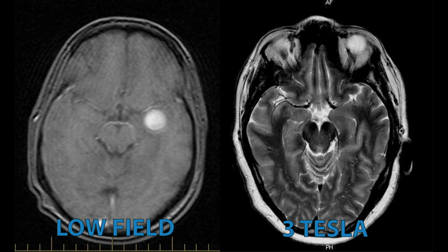There is now being used at a small number of facilities what's called a 3T MRI machine. And that is a much higher resolution MRI than the 1.5 T, and certainly much higher than the 0.2 T to 0.7 T open MRI machines. You can see so much more on those. And we're taking cases now that are done at different imaging facilities, and sometimes we'll have the study redone on the high resolution imaging set at the 3T machine.